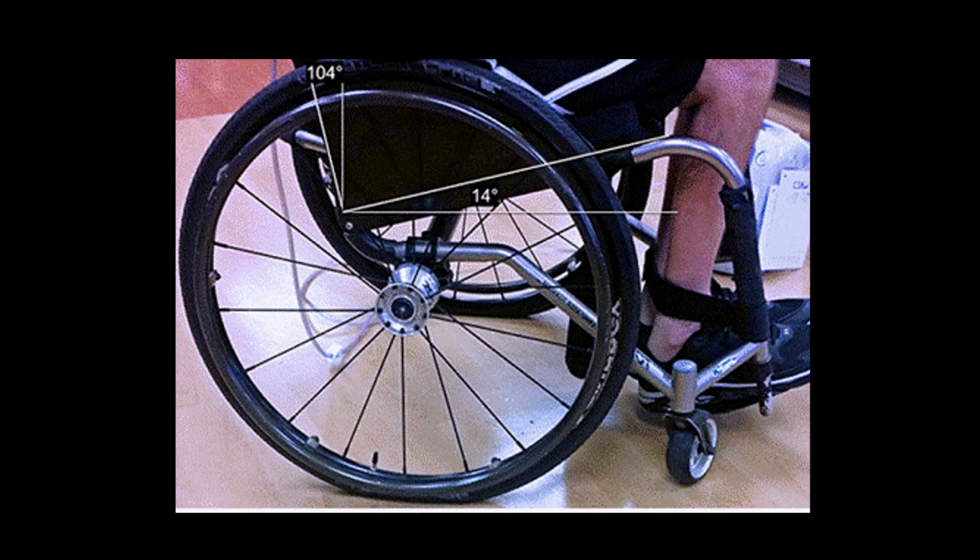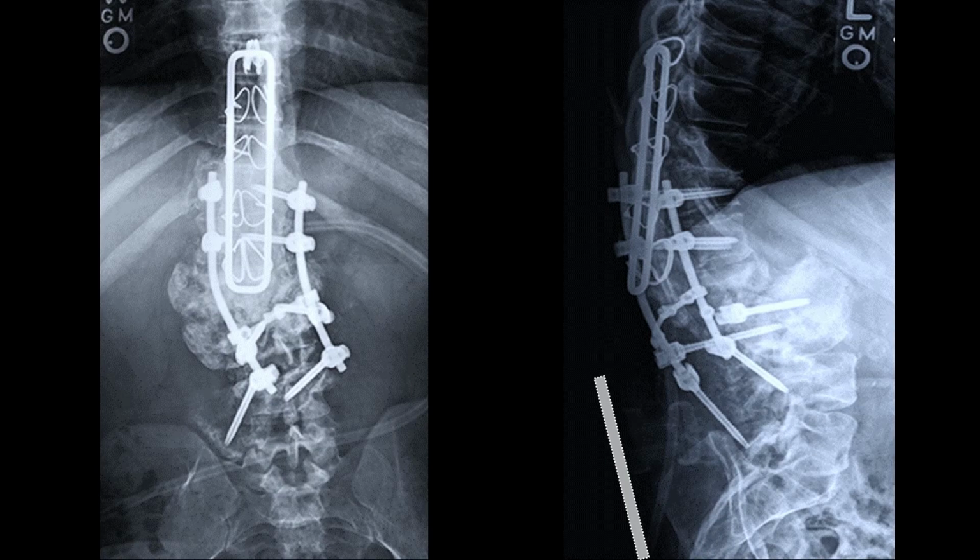But what I didn't realize until I looked at his specs when he was admitted for another issue was that Top End was using the frame to measure 90. They weren't using the ground like most manufacturers. So that effective back angle, using a lot of other manufacturers' methods, was 104. So it was doing absolutely nothing for him. So he's probably actually even having to use what back muscles he had to keep him from sliding back in the seat. But this is what happened.